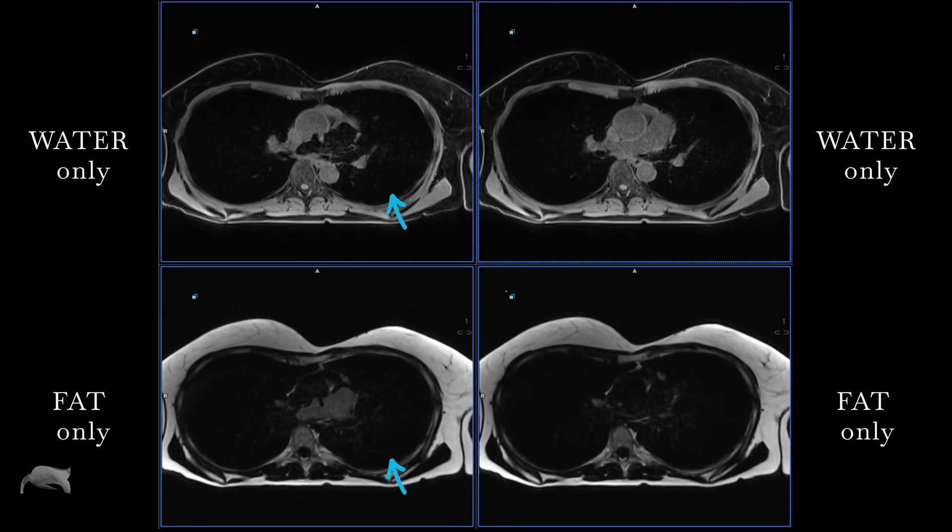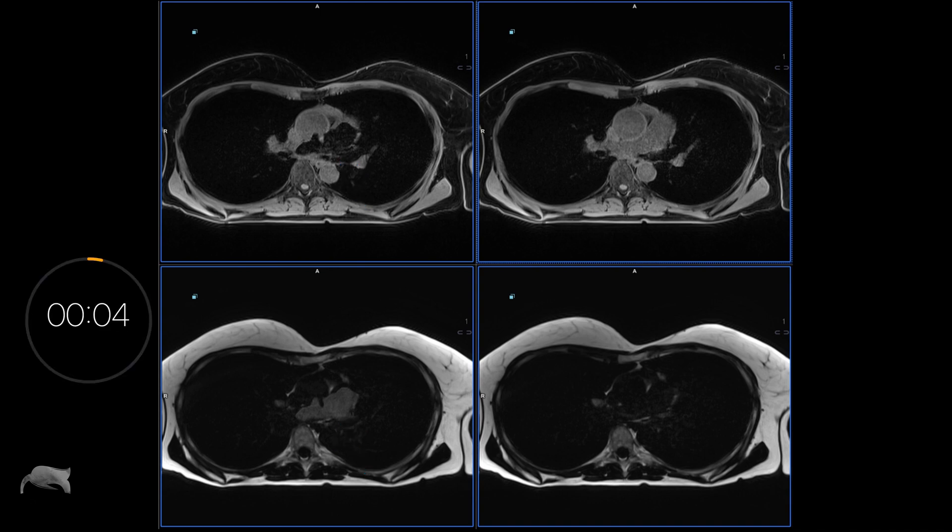I went from the Dixon swap — you can see the water-only and then the fat-only there — to non-Dixon swap in a thorax area. So it's as easy as that, only one change. But to mention, it's not always working, but it sometimes works, so it's a smart move to try that whenever you are having Dixon swap.